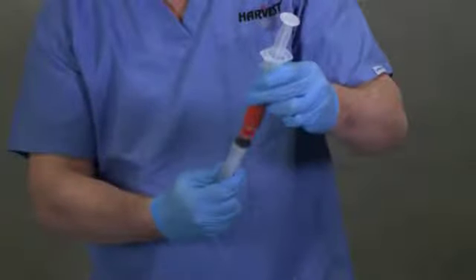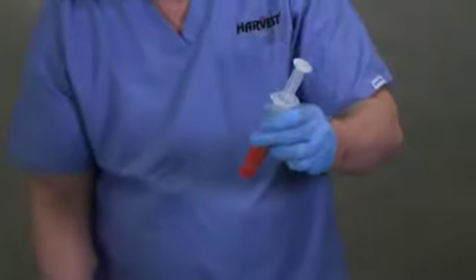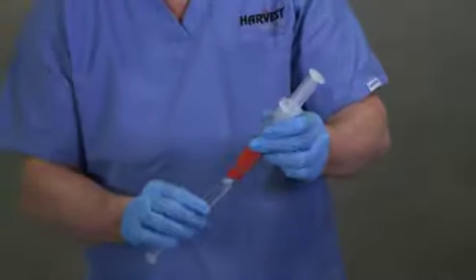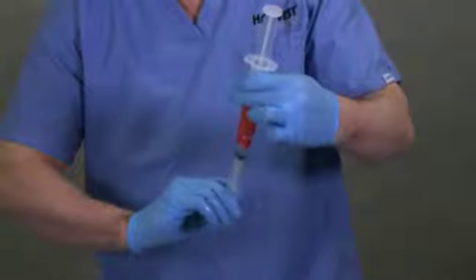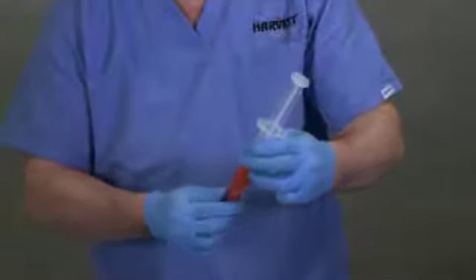Fill a separate 10 milliliter syringe with 8 to 10 milliliters of sterile saline. Connect the syringe containing saline to the wash syringe via the female-to-female connector. Position the connected syringes so the saline syringe is on the bottom, vertical to the wash syringe. Expel the saline solution into the wash syringe.